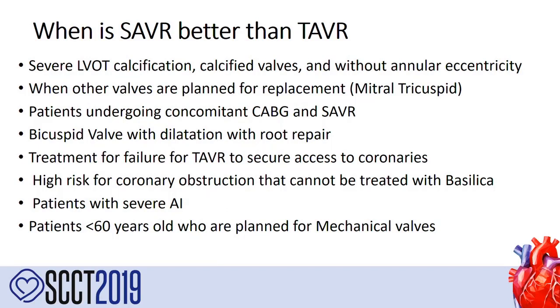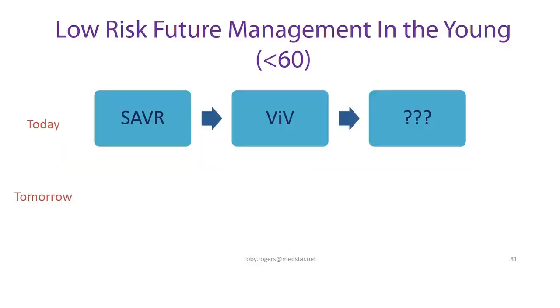So I would say that these are the situations when SAVR is better than TAVR. I mentioned them, and I'll give you one last scenario to end here. What do you do with a patient less than 60 years old? Today, he's definitely going to SAVR. Maybe 10, 15 years after, he's going to have a valve-in-valve. And after that, I'm not sure, maybe another valve-in-valve. But remember, when you do two valves-in-valves, you're basically obstructing the access to the coronaries, and those patients at the age of 80 may need some coronary intervention.